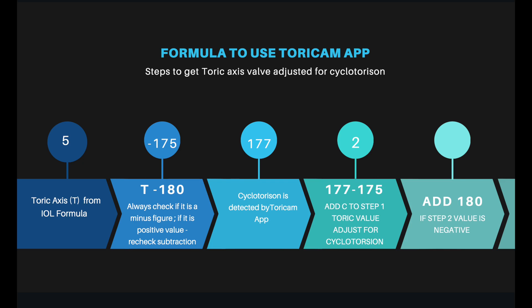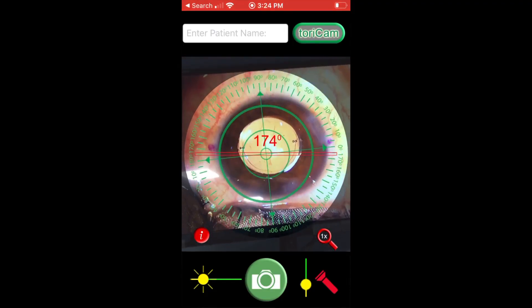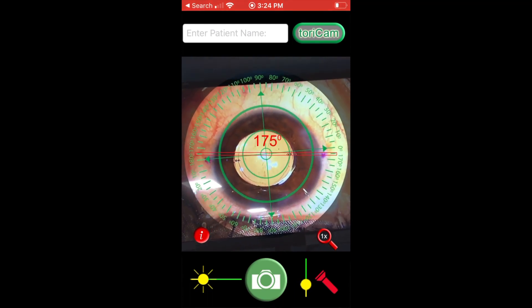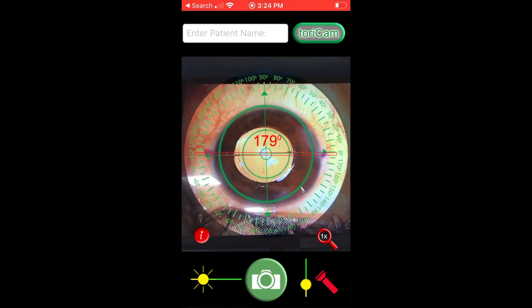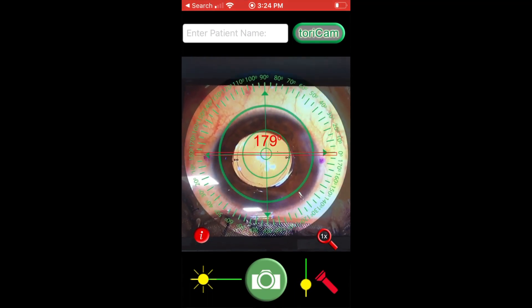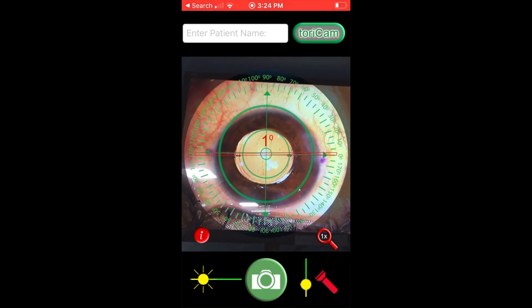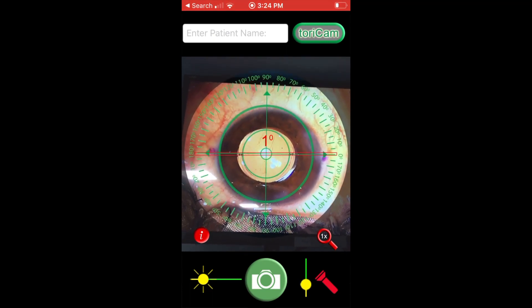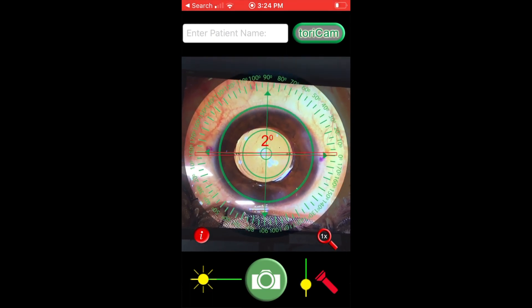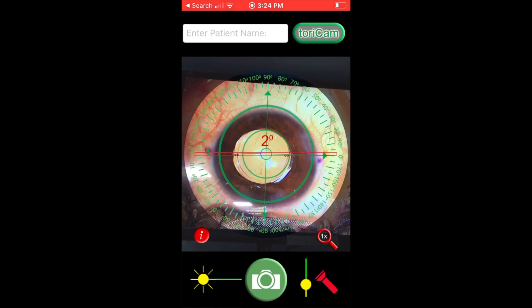If this value was minus, we would have to add another 180 and that would be the final value to use on the app. After placing the IOL, we again open the TORIC M app and align the axis to see whether the IOL holes are now aligned at 2 degrees. This is successful alignment.